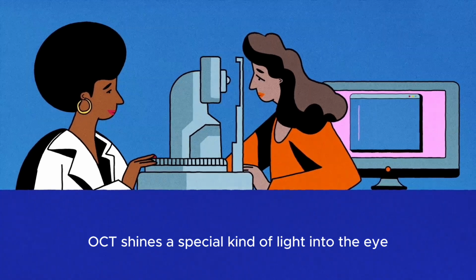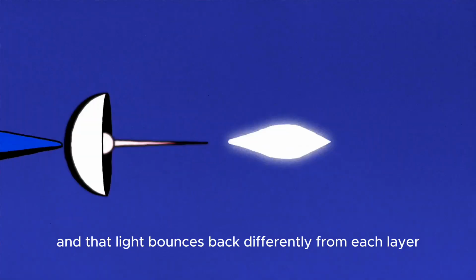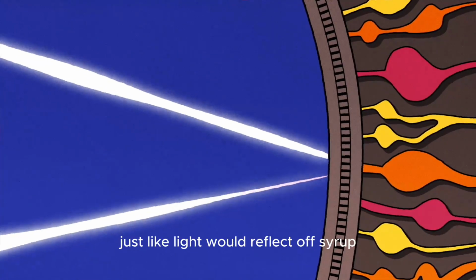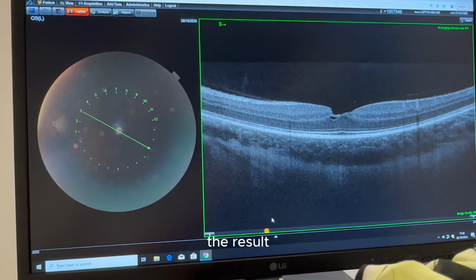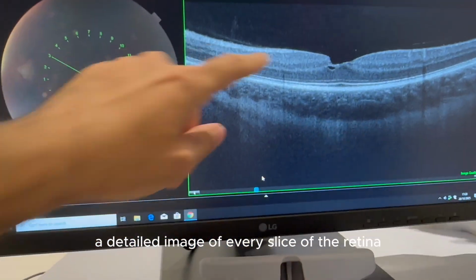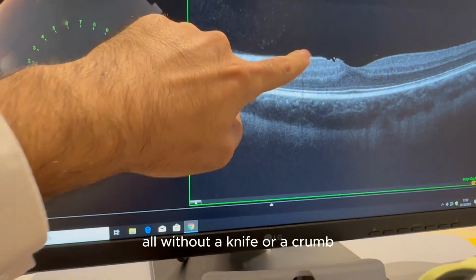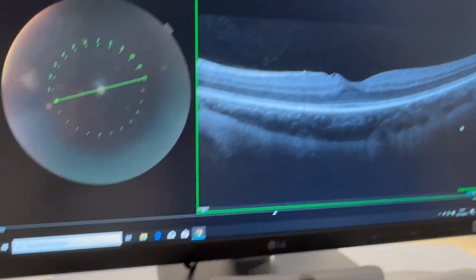OCT shines a special kind of light into the eye, and that light bounces back differently from each layer. Just like light would reflect off syrup, nuts, or pastry in a baklava. The result? A detailed image of every slice of the retina, all without a knife or a crumb. Now, let's trade our dessert fork for some physics.